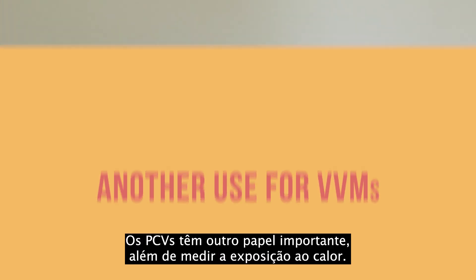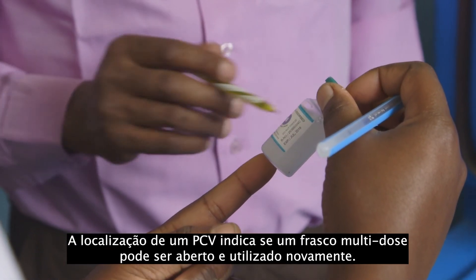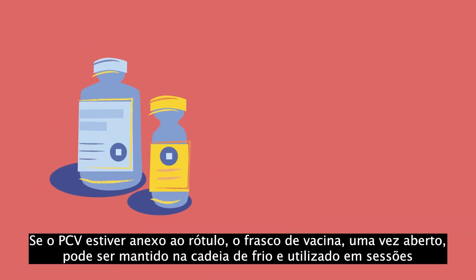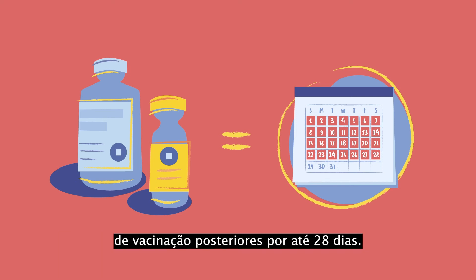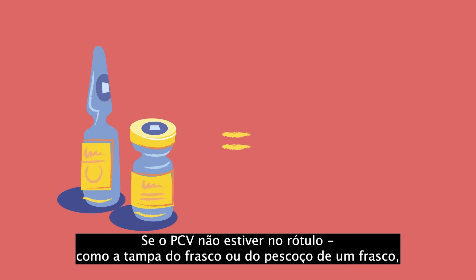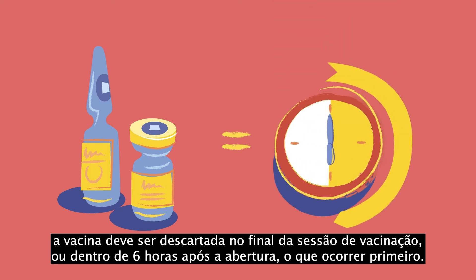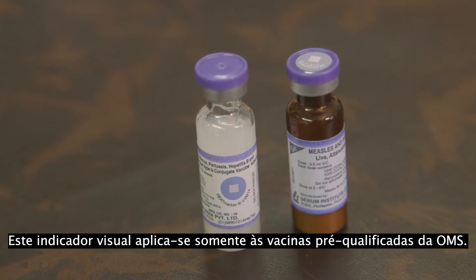VVMs have another important role beyond measuring heat exposure. A VVM's location indicates whether a multi-dose vial can be opened and used again. If the VVM is attached to the label, the vaccine vial, once opened, can be kept in the cold chain and used in later immunization sessions for up to 28 days. If the VVM is not on the label, such as on the cap of the vial or neck of an ampoule, the vaccine must be discarded at the end of the immunization session or within six hours of opening, whichever comes first. This visual trigger applies only to WHO pre-qualified vaccines.